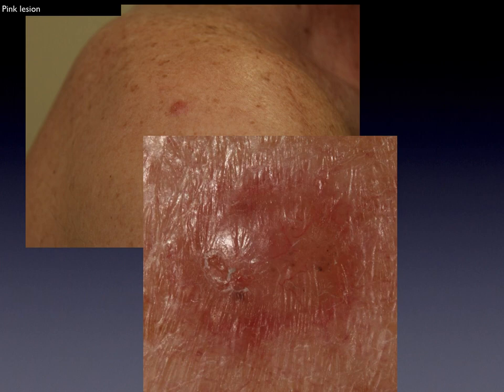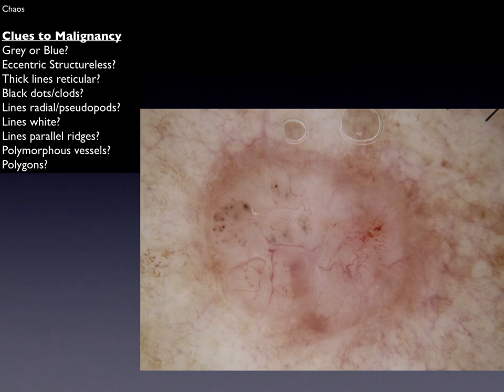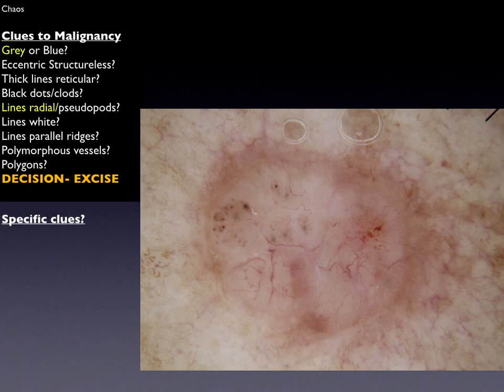This lesion on the shoulder is red, and we cannot recognize it as a nevus, a benign keratosis, a hemangioma, a dermatofibroma, or a sebaceous gland hyperplasia. It is asymmetrical, it's chaotic, and there is the clue of gray color and lines radial segmental — and we make the decision to excise.